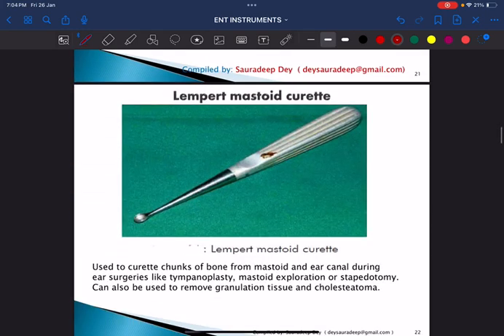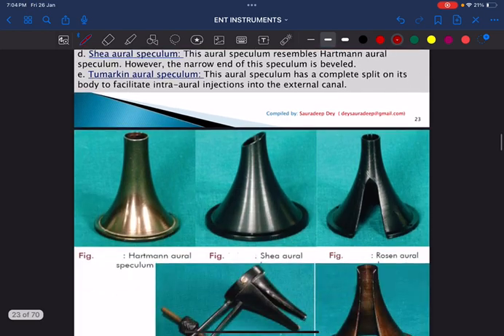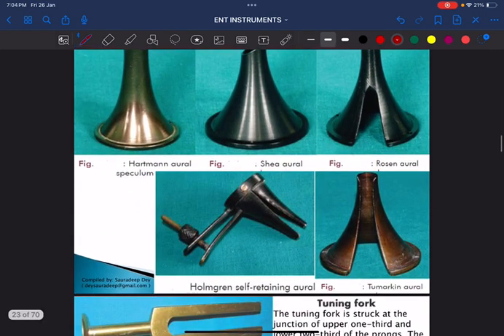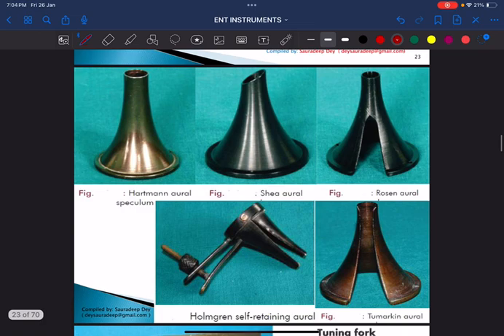This is Lempert's mastoid curette, shaped like a small spoon. It is used to curette chunks of bone from the mastoid during surgeries like tympanoplasty, mastoid exploration, or stapedotomy. It is also used to remove granulation tissue and cholesteatoma.